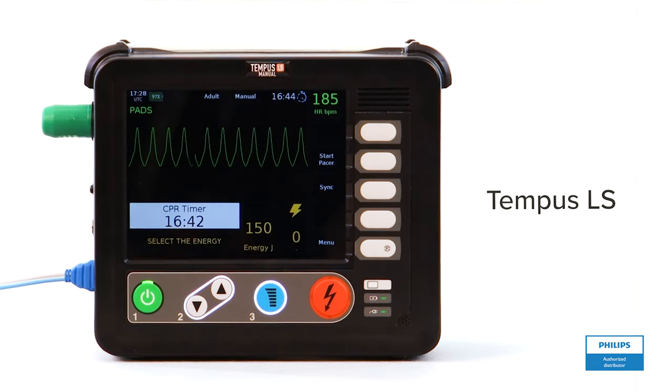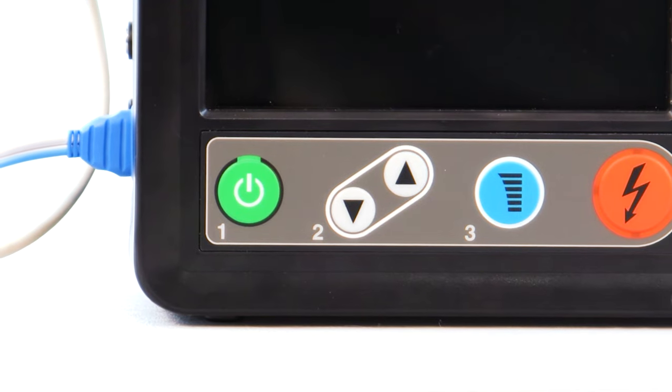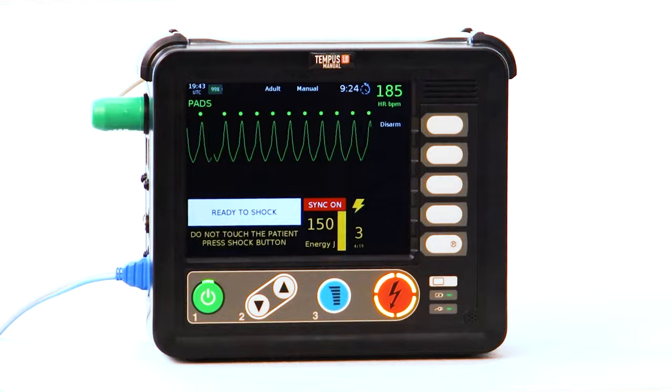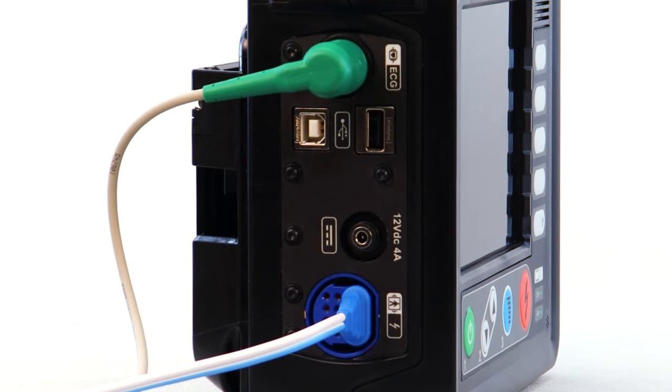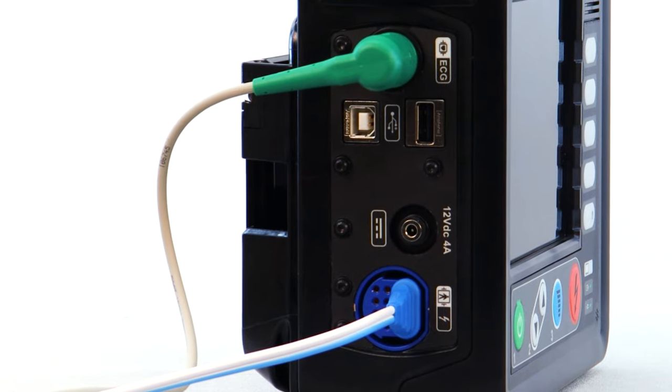This is a demonstration of the Philips RDT Tempus LS manual defibrillation device. The Tempus LS is the therapy portion of the Tempus ALS system and is capable of defibrillation, cardioversion, and pacing. In addition, the LS can function as a standalone ECG monitoring device on multiple patient scenes if needed.